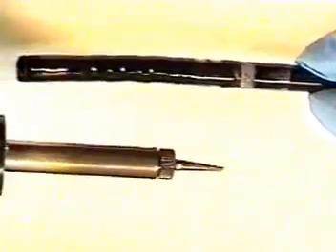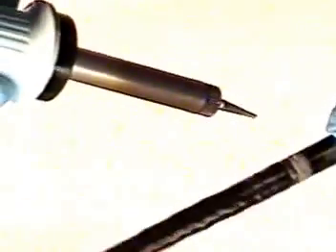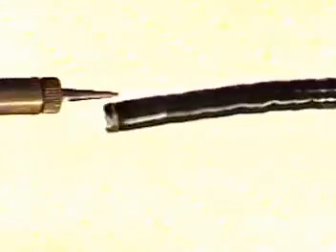Once our epoxy has set up according to manufacturer specifications, we can glue the endoscope bending rubber sheath. Before we glue, we will take our soldering iron hot and we will melt away any loose threads or bending rubber sheath that stick out. Be extremely careful not to melt into the bending rubber or bindings that we have made previously. The solder iron will melt away any strands or any debris that sticks out, which would cause the bending rubber glue to have foreign objects sticking out, which cosmetically will spoil the glue job.